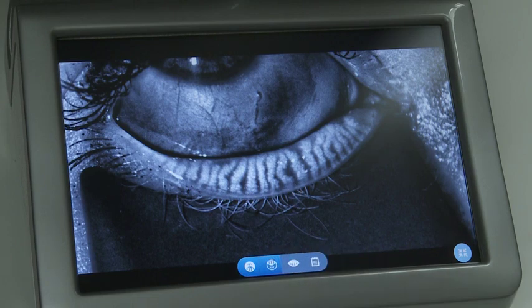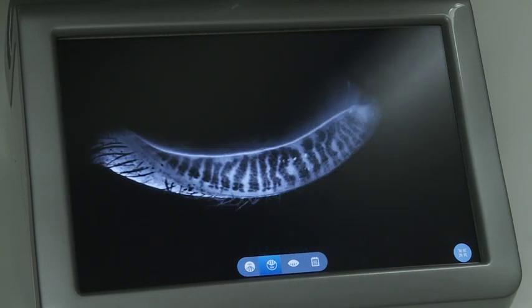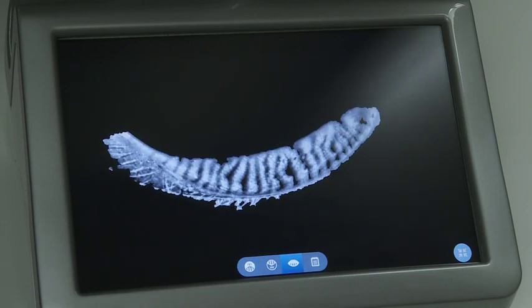The trans IR image is only for the lower eyelid gland images when using the lid everter. The glands will appear dark, and the spaces between the glands will be white. The merged view is for the lower eyelid images and combines the reflected IR and trans IR images. The glands will be white, isolated against a dark background.